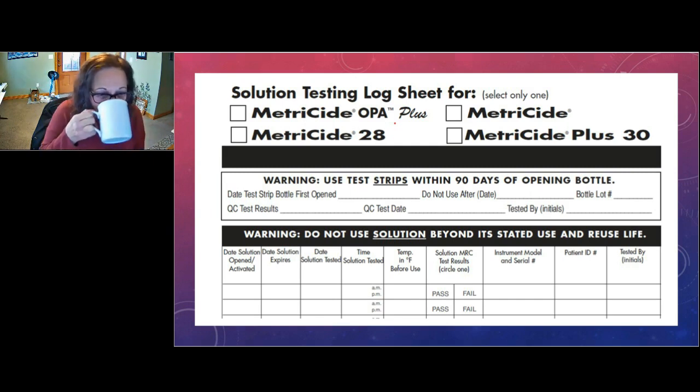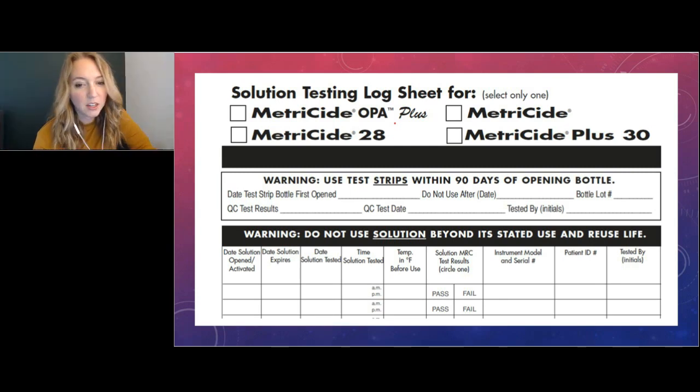Okay, next question says, can leftover local anesthetic cartridges be placed in cold sterilization for 1 or 2 hours and rinsed with water or saline, allowed to air dry, and then be reused?